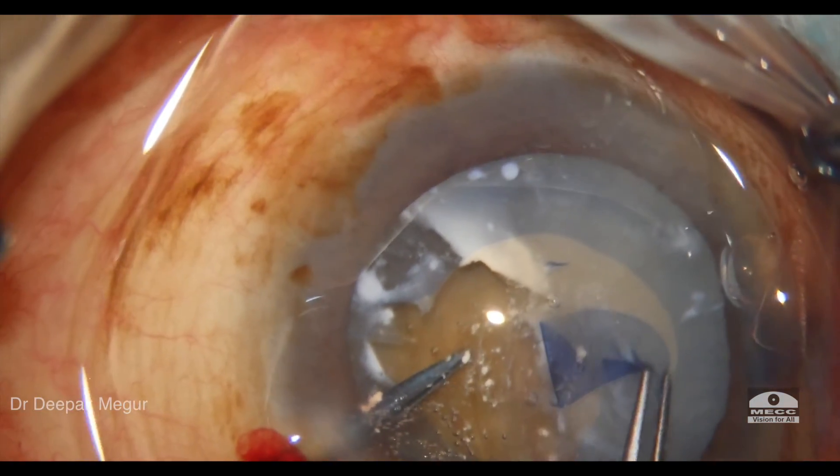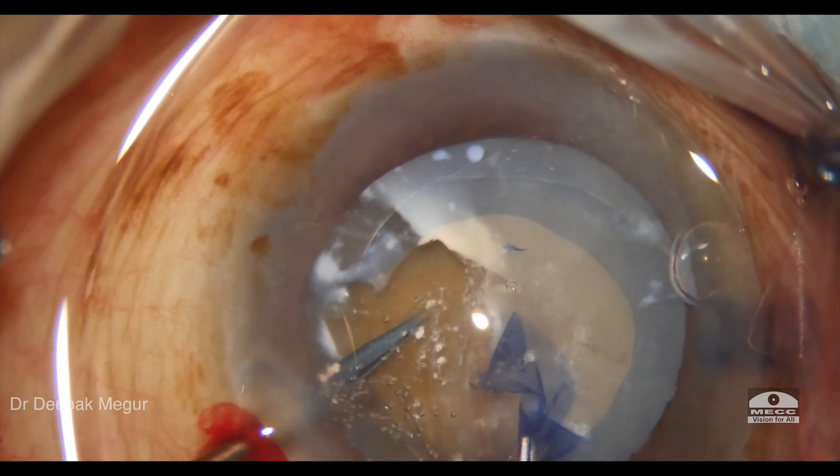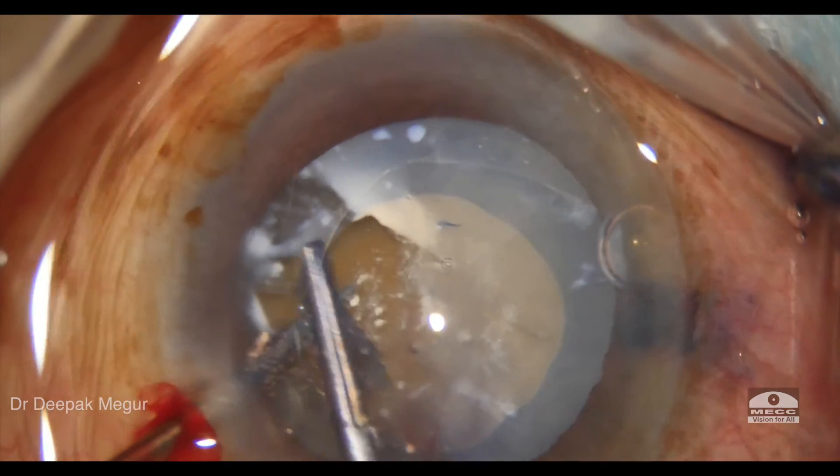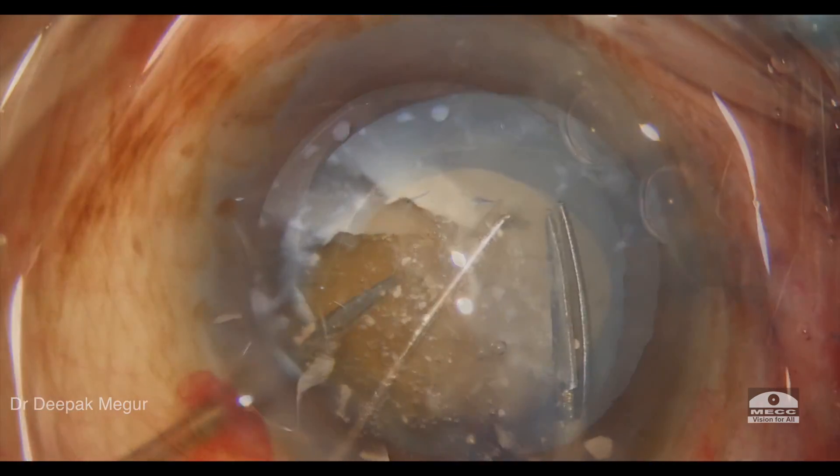In the non-calcified zones, the capsule behaves in a completely normal way. So the message again is: deal with the underlying calcified areas first, and then tackle the healthy capsule.